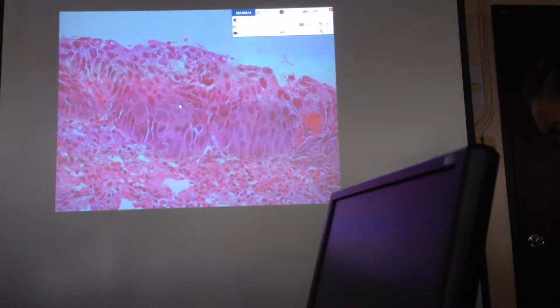Okay, so when you say cervical intraepithelial neoplasia, there will be the presence of atypical cells within the epithelial structure, and it is limited by the basement membrane, which means that there's absence of stromal invasion. So matatawag mo lang siya as CIN. But if there's stromal invasion, then you call it squamous cell carcinoma. So the CIN classification would be dependent on the location of the atypical cells.